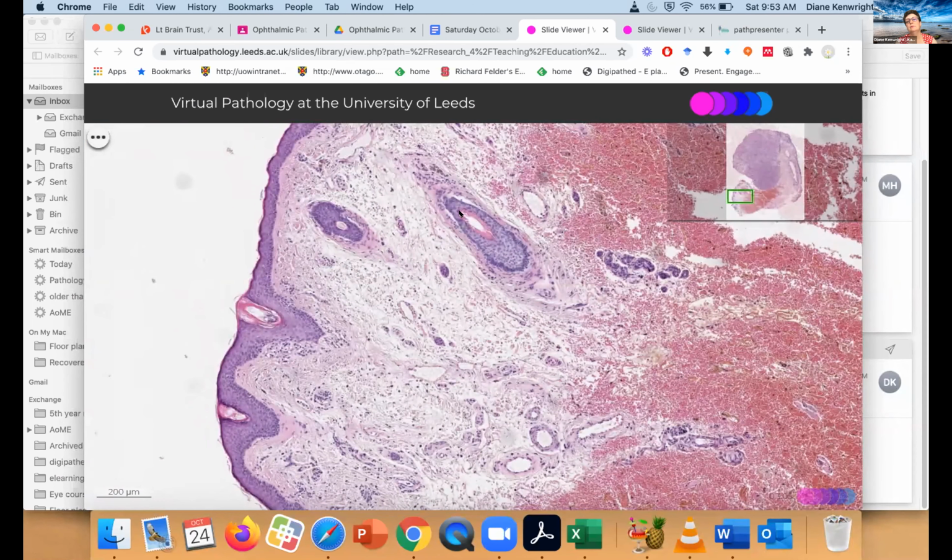So it's quite a big exophytic, but also invasive mass that's destructive. So I'm suspecting that this is an invasive destructive lesion. And then if I look here, I want to know whereabouts is it arising from? Is it arising from the epidermis or is it arising from the dermis? And we can see here that there's still some cells at the dermo-epidermal junction. It doesn't appear to be the epidermis is streaming down. We've got cells at the dermo-epidermal junction. So I begin to suspect that this is a melanoma.